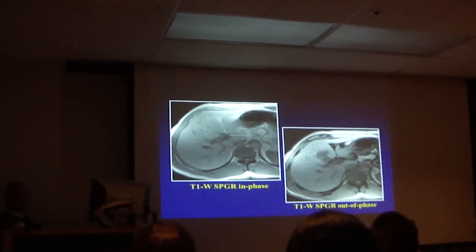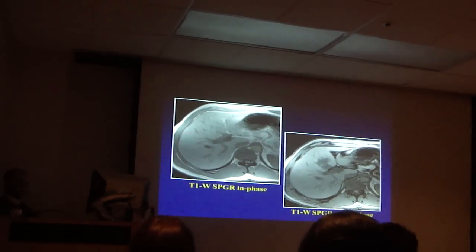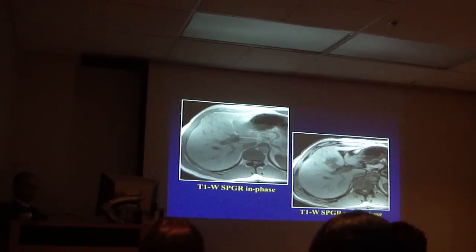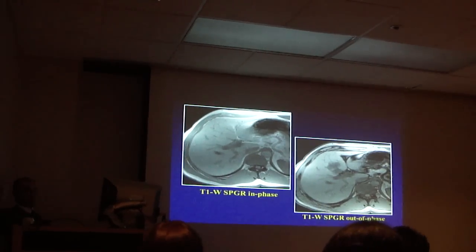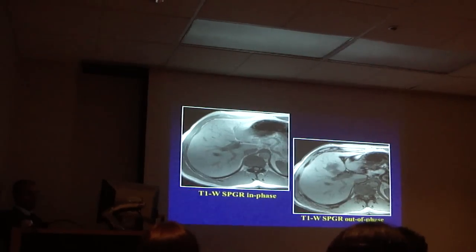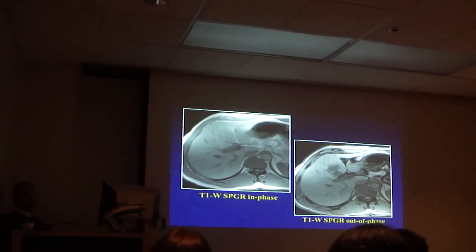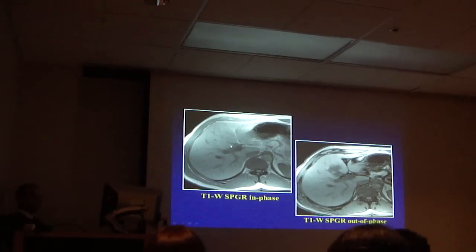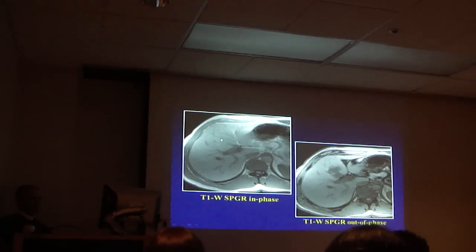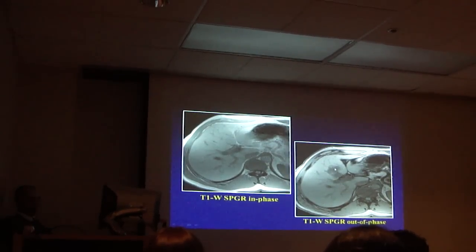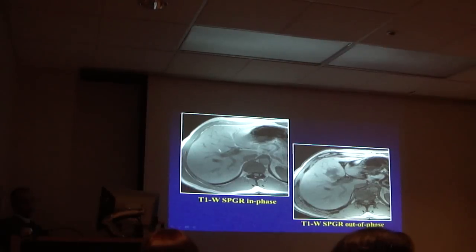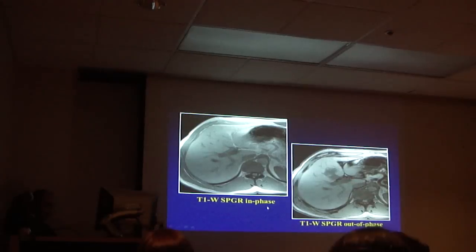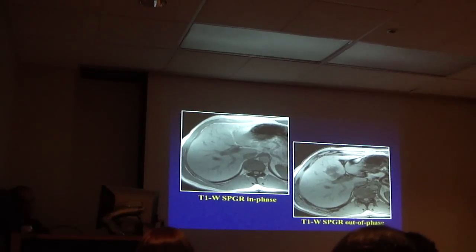What is happening here? Signal drop indicating the presence of fat. Look at the vessels — you don't see the vessel here because of the fat within this area, but the vessel is going through it. A lesion would normally displace the vessels. This could just be a focal fat deposit.